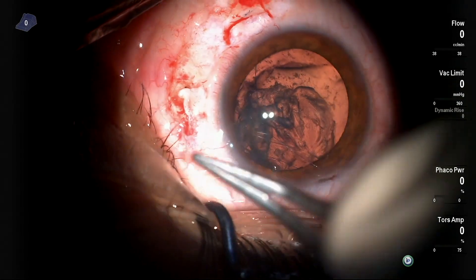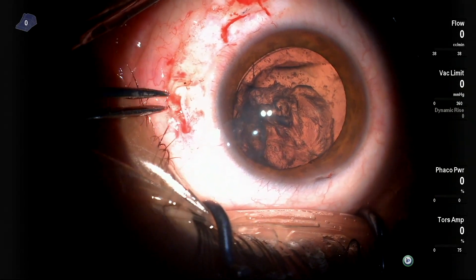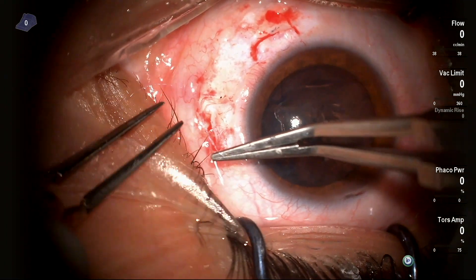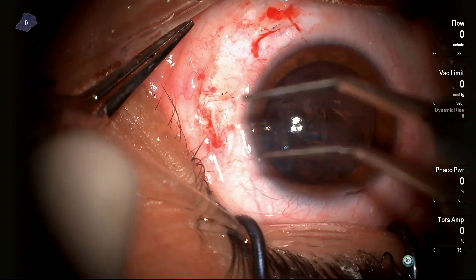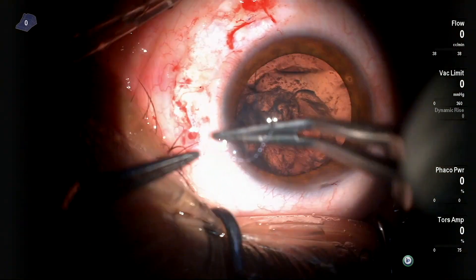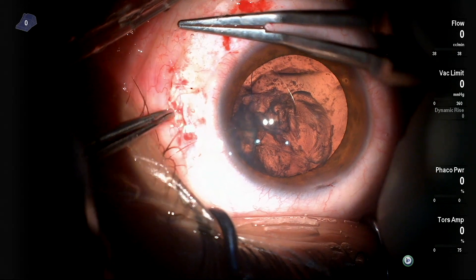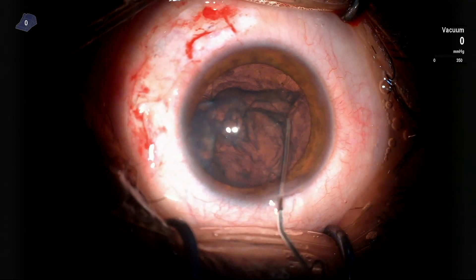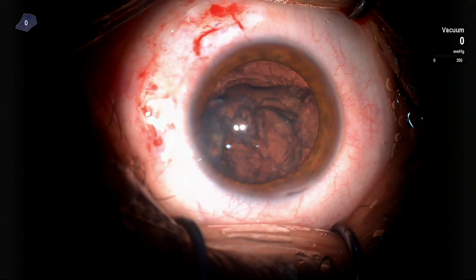It was manageable. After that, the suture was tightened so that the CTR would have complete support nasally and inferiorly, which are the weak areas in the zonules.